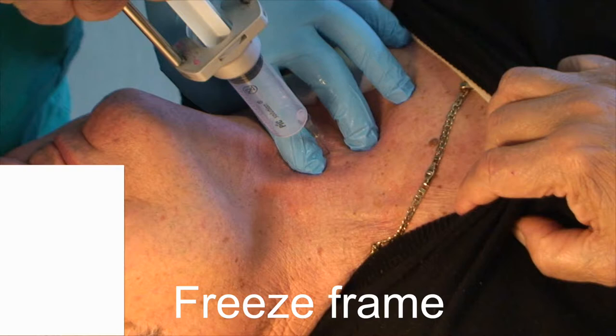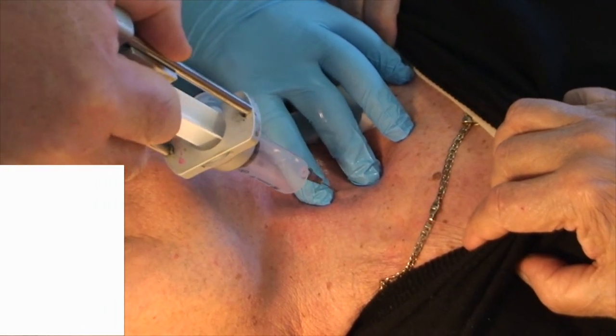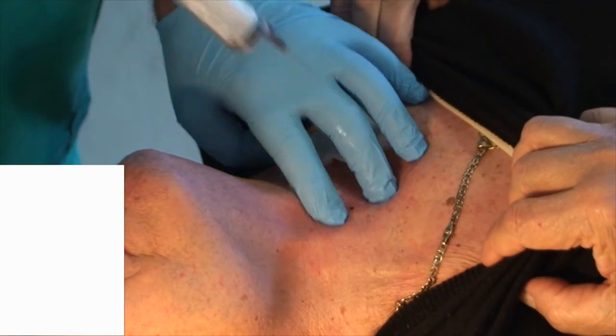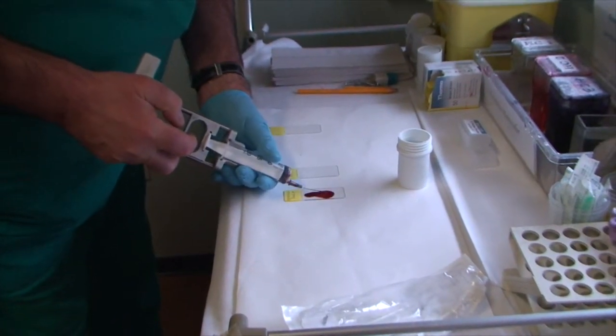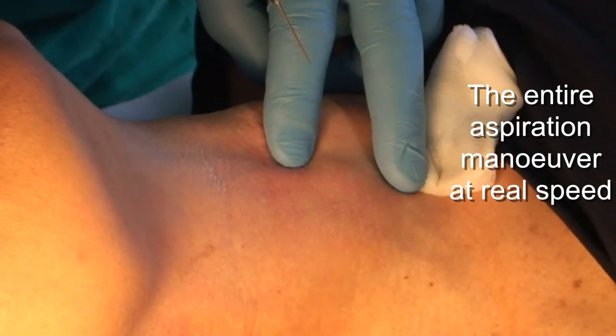As aspiration is maintained at a steady rate, the needle moves forth and back by approximately 4–8 mm while changing the inclination each time. In the meantime, the hand rotates twice. After five or six passes, the movement is discontinued. While the tip of the needle is still in the node, the plunger is gently released. Immediately afterwards, the needle is extracted. Whenever the syringe comes out filled with blood, which prevents interpretation of the cytological test, it is better to discard the specimen and take another sample.